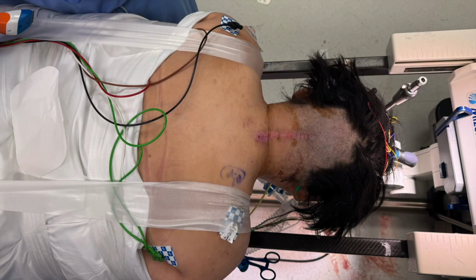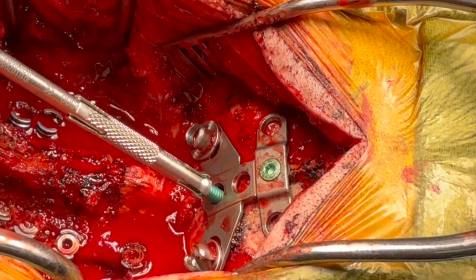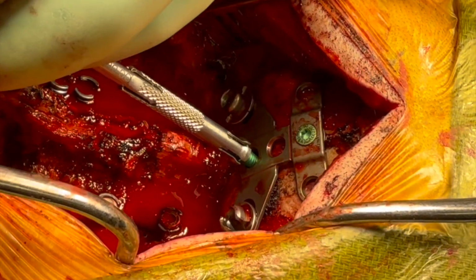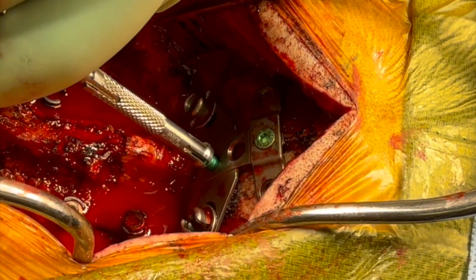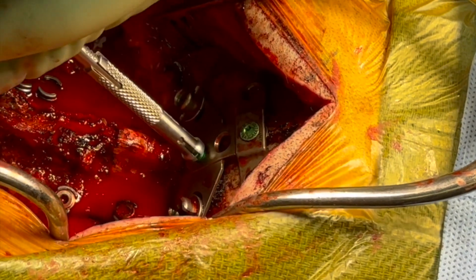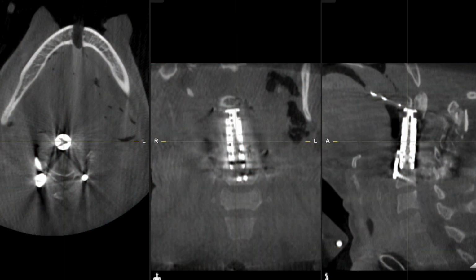The patient was then flipped prone for an occiput to C6 posterior spinal fusion. During this procedure, the left C1 lateral mass screw was removed, bilateral C6 lateral mass screws and occipital plate were placed, and rods were placed from the C6 screws to the occiput. A final intraoperative CT spin was obtained to confirm the position of the hardware.